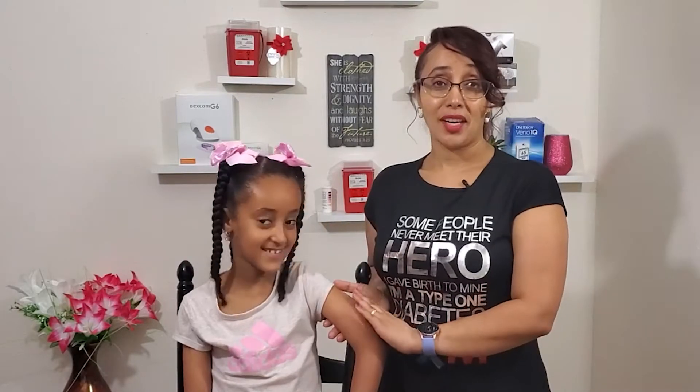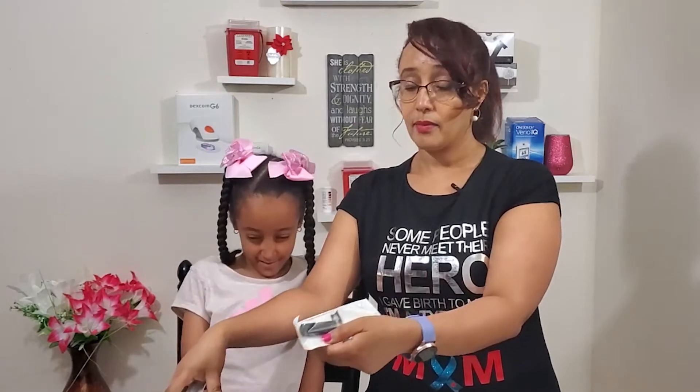I will show you how to use the insulin pump. We can use the pre-filled cartridge. This is how we use the pre-filled cartridge. It's much cleaner. We have to prepare the pre-filled cartridge with the insulin.